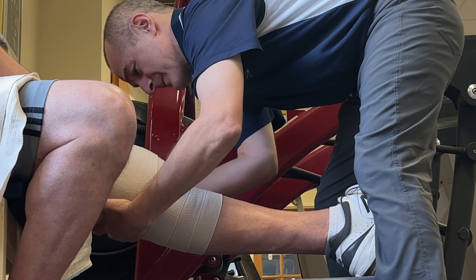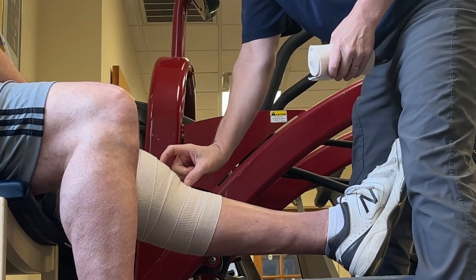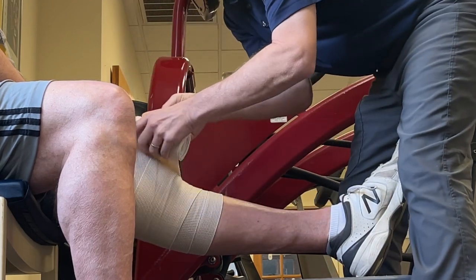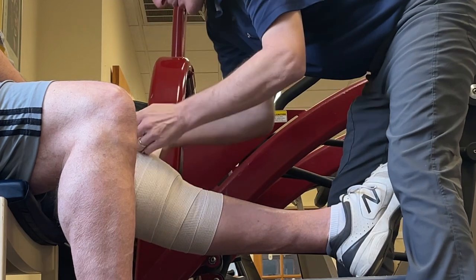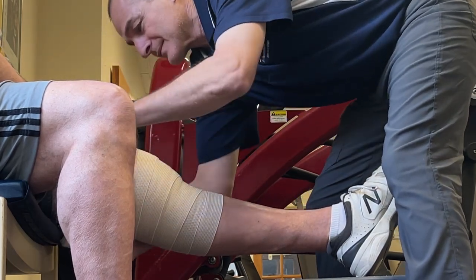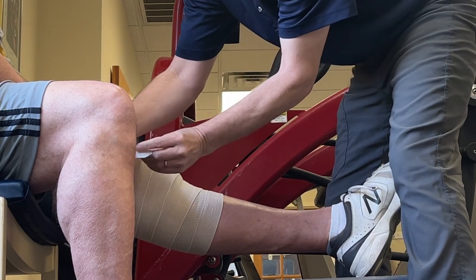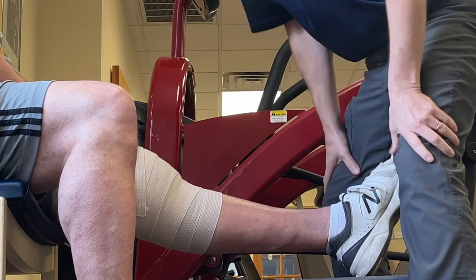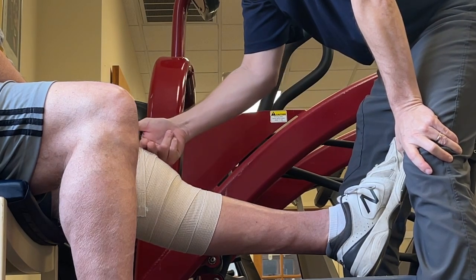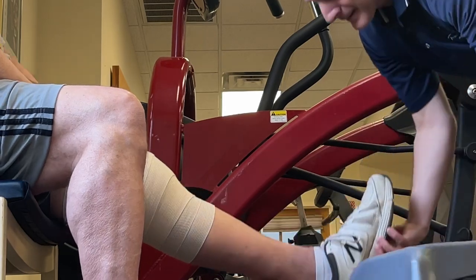We got that one on there. Now I'm gonna come right about here — there's no exact requirement, you're just kind of experimenting. I'm wrapping over probably more than half of the previous wrap but going just a little bit higher. If I finish like that I can just fold it over and leave it there. The overlap is pretty much all the way up except this last one — I came back down a little bit just to get it stuck on there.